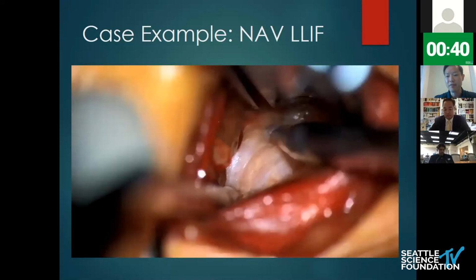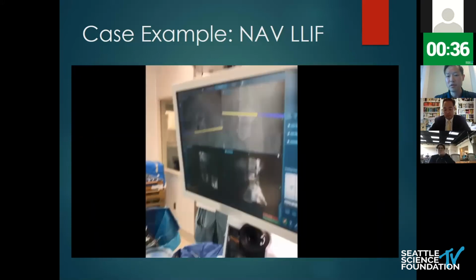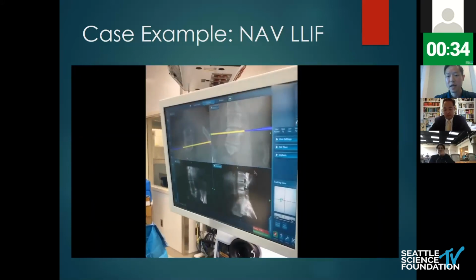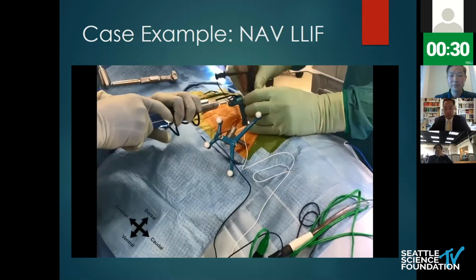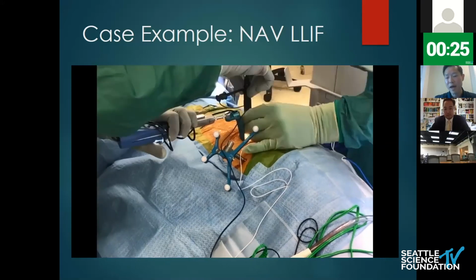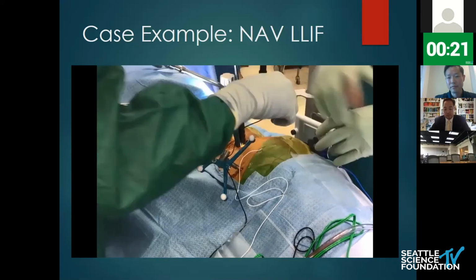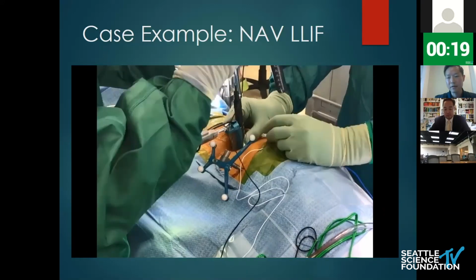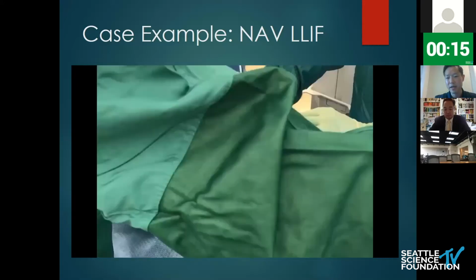There's a navigated dilator, and it's being used to traverse the psoas as a classic transpsoas procedure. We're going to anchor it into the disc space. We'll sequentially dilate with nerve stimulation. This is directional, so we're mapping the plexus here. And then the final dilator. Again, each dilator can be stimulated, and it's directional. It's just where the clip is attached.